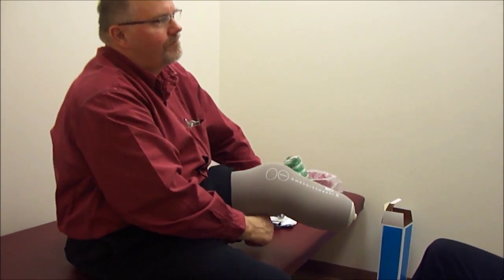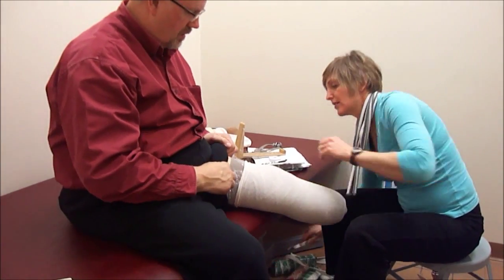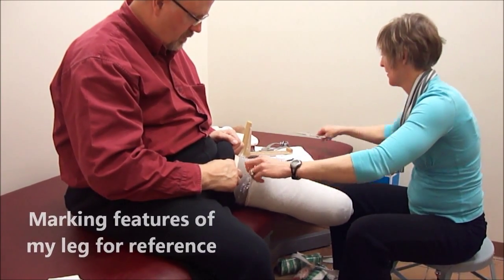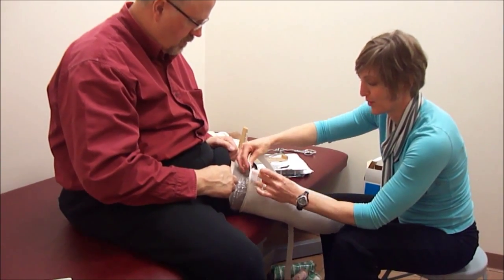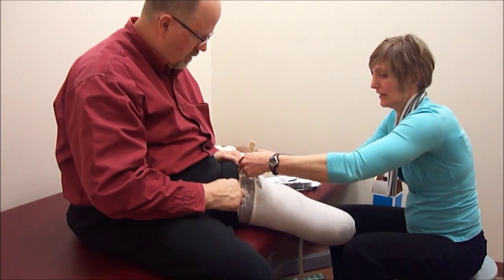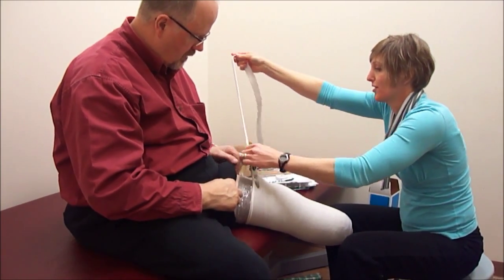Yeah, that little kink in the back just doesn't want to cooperate with you. There you go. I don't want that to slip down at all, so I'm going to be attaching that with a little belt behind you. But this should be the only time you'll have to wear a belt with your leg. I've had people get kind of nervous when I put this on, thinking, oh, I'm not going to have to use a belt to keep the whole darn thing on, am I? And no, you're not. Gotcha.